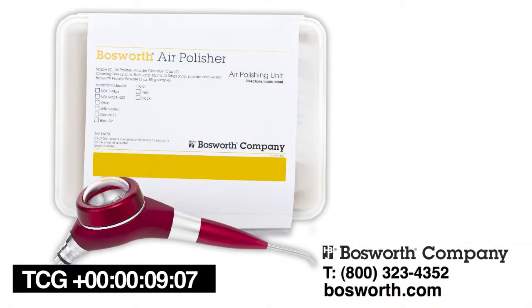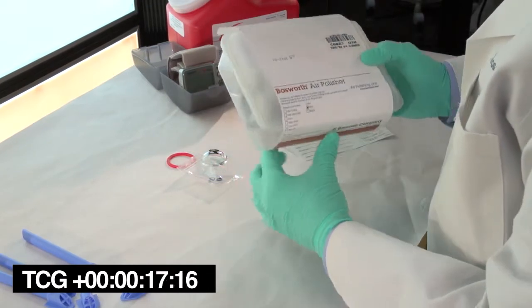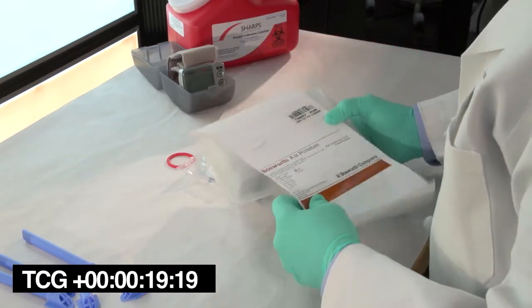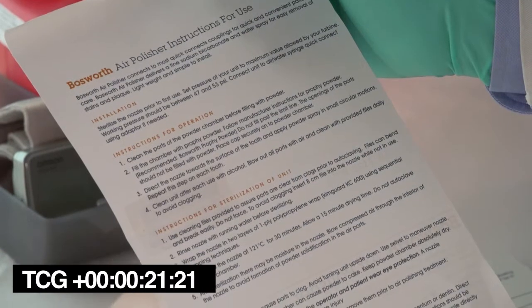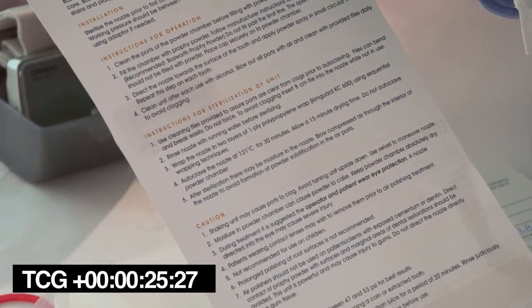Congratulations on your decision to incorporate air polishing into your practice. Follow these steps prior to using your polisher. The outer wrapping of the package contains the instructions for the use and maintenance of the air polisher. Please read prior to use. For future reference, keep instructions in a safe place.